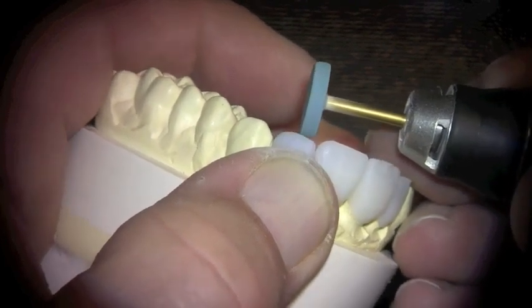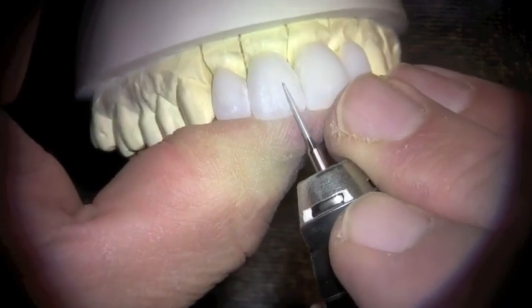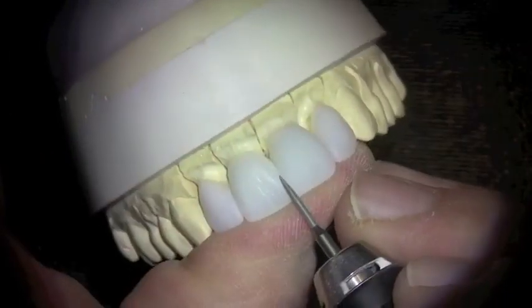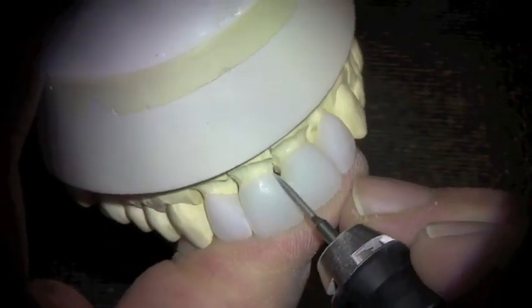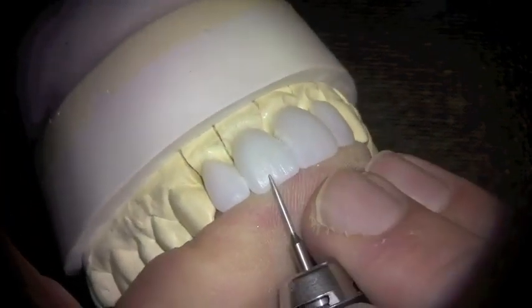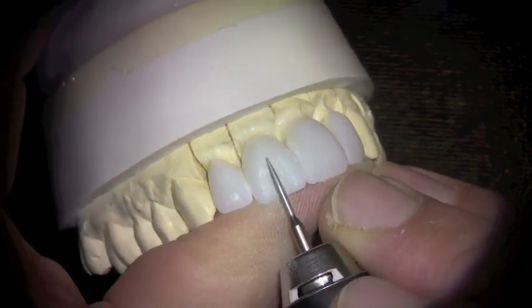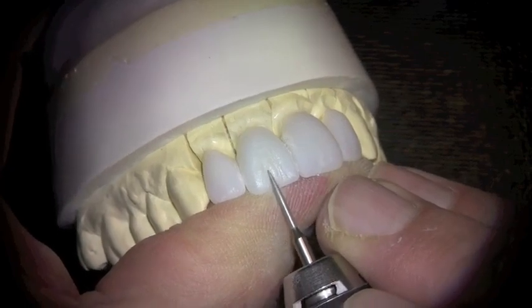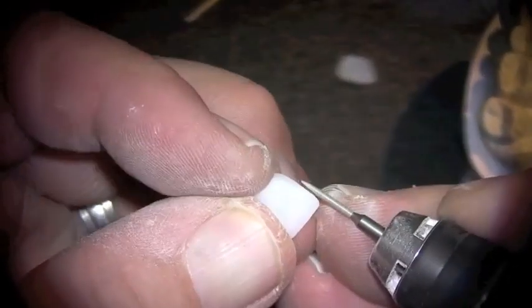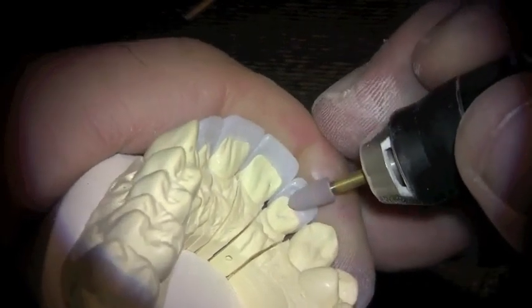Here I'm using Brasseler's lithium disilicate and zirconia grinders. They cut very quickly. Now I'm using a Brasseler's 863 burr, and this is what I do most of my surface morphology with. Here I'm again working on that area between the teeth. Where that contact is positioned is most of what is important with our aesthetics. All the surface morphology that we're doing out here looks neat and we get excited about that. It's kind of fun, but really positioning that contact and controlling the light into that embrasure form is what really makes or breaks a case.